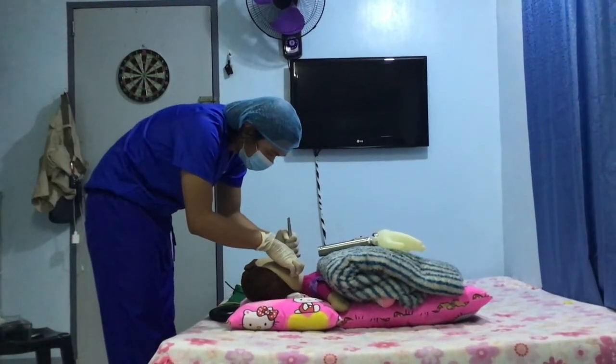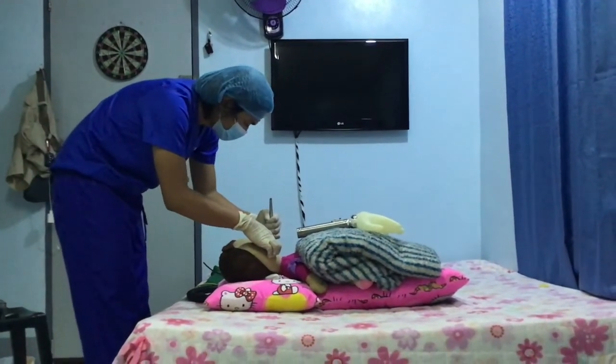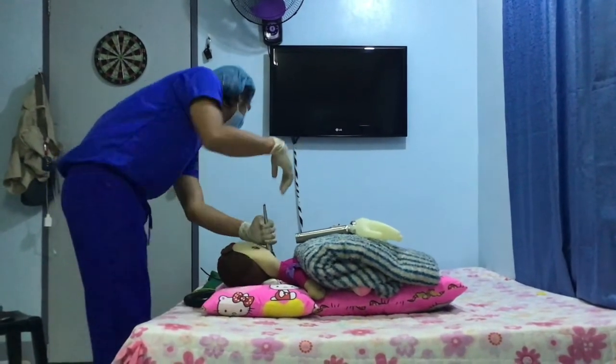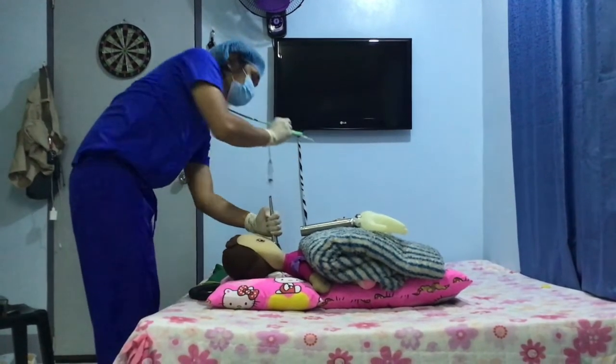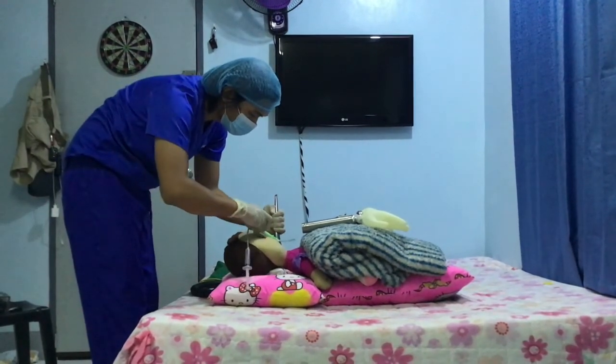Lift the blade upwards towards the direction of the handle and avoid rocking back using a wrist motion. Keep your wrist fixed and move your forearm. Once the vocal cords are seen, insert the endotracheal tube with stylet at the right side of the patient.